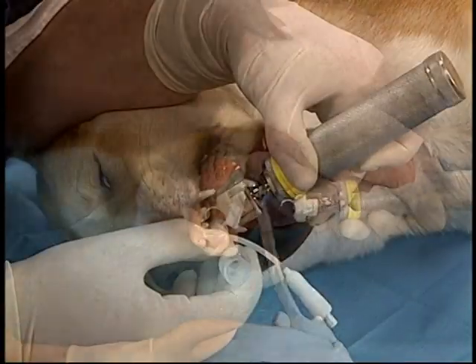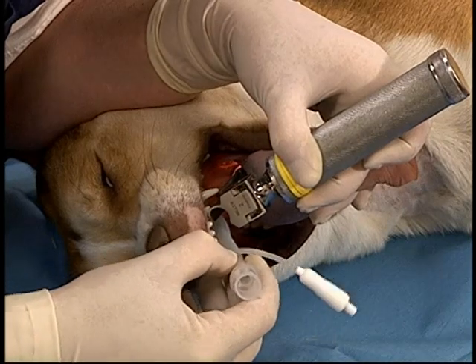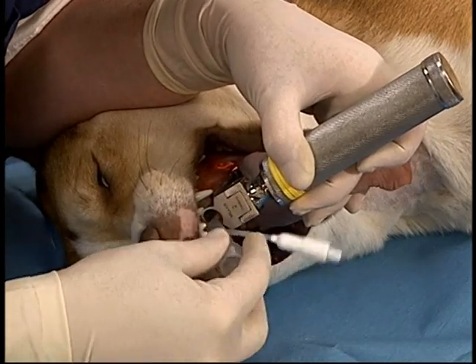Again, the use of the laryngoscope avoids stimulation of the larynx, which can cause problems in critical patients.